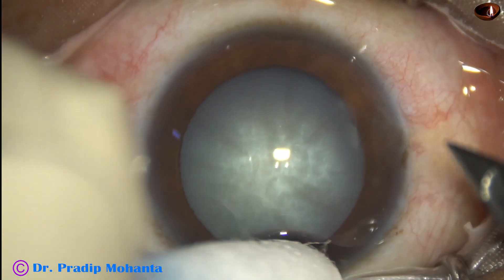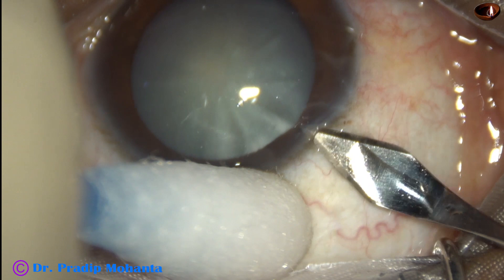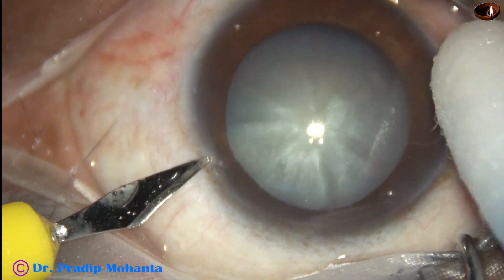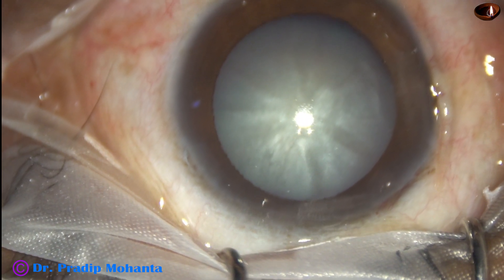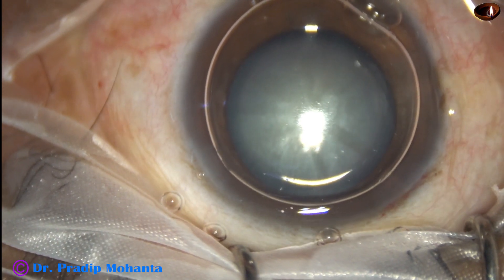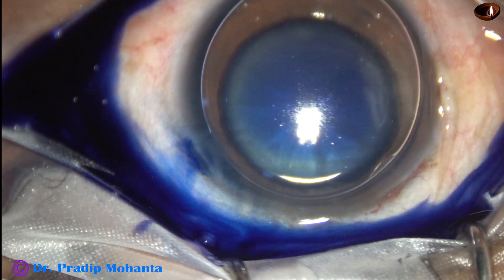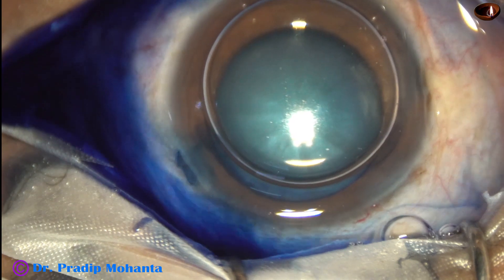This patient is under topical anesthesia. In intumescent cataract, if you are a new surgeon, it is better that you give block, because intumescent cataract is a challenge itself. By placing the case under topical, you are adding on more challenge. It is better that you do such cases under block, but the orbital pressure should not be raised. You can administer IV mannitol before surgery so that there is some shrinkage of the vitreous cavity. An optimum amount of block should be given.